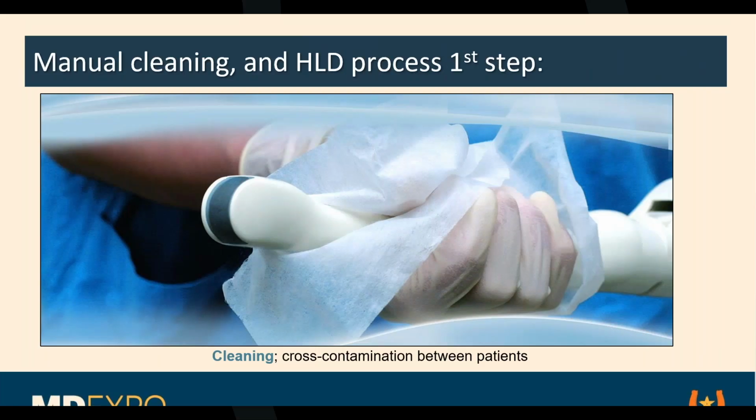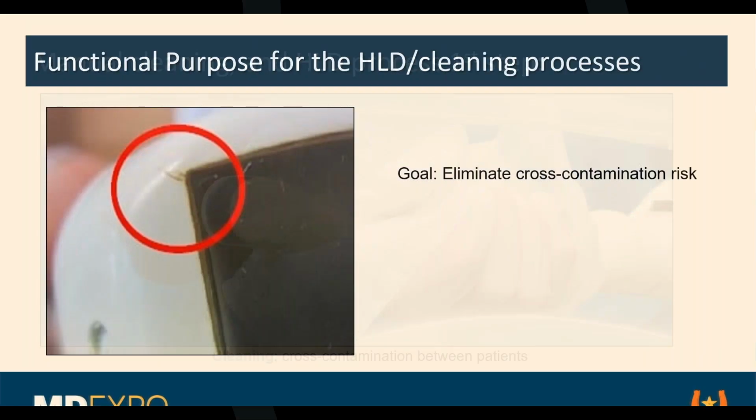Remember, it's been soaking in the gastric juices for 4 hours, and when it comes out, it's very susceptible to damage because it's turned into bubble gum at that time. We get them in even with small cracks. This is why visual inspection with a 10x loupe is absolutely important to have.